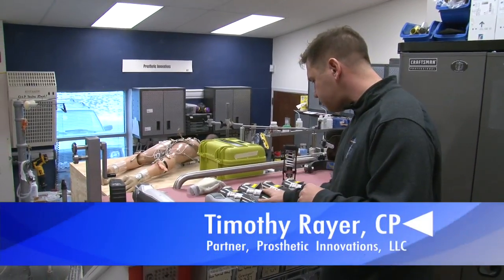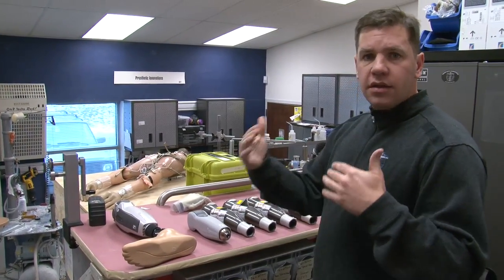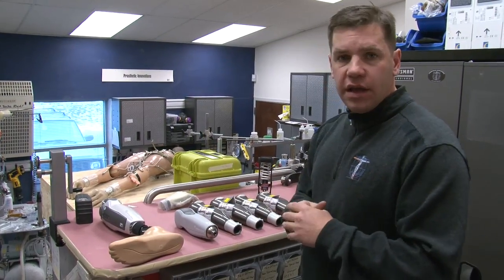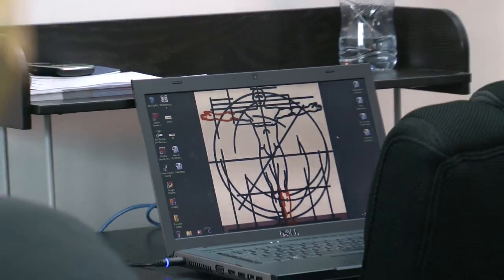This is an example of some of the stuff that we use. We use a lot of microprocessor knees — that's really become kind of the standard protocol for above-knee amputee care. We also have a unique opportunity to use some really emerging technology.